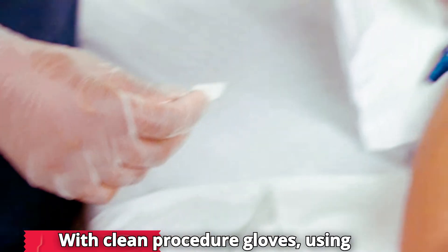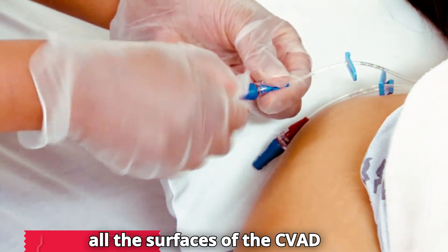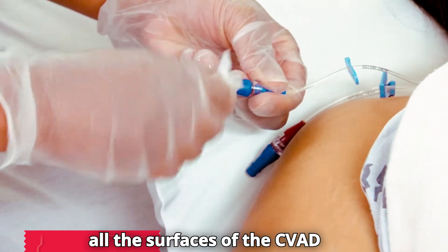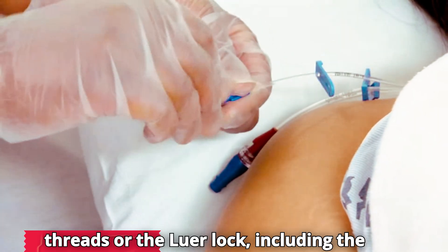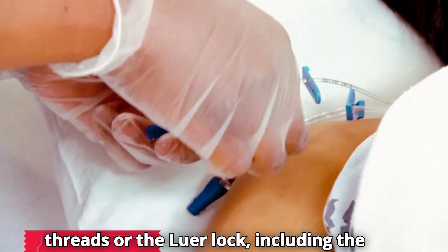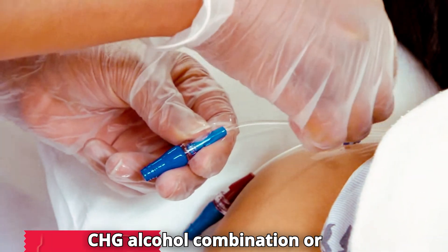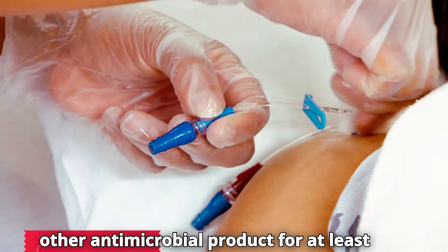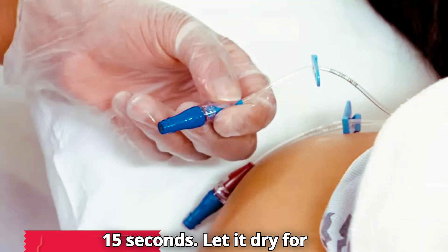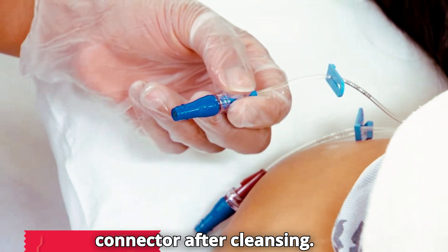With clean procedure gloves, using pressure and friction, vigorously scrub all the surfaces of the CVAD connectors, as well as the luer locking threads or the luer lock, including the extension tail with an alcohol wipe, CHG alcohol combination, or other antimicrobial product for at least 15 seconds. Let it dry for 15 seconds. Do not touch this connector after cleansing.